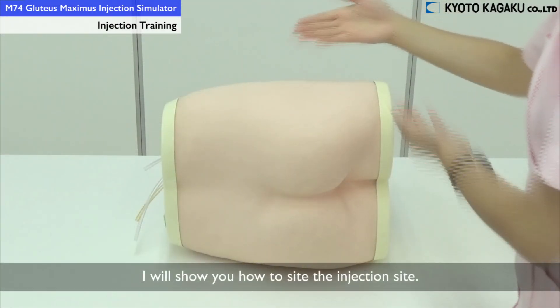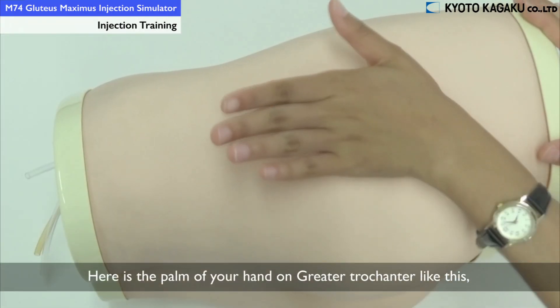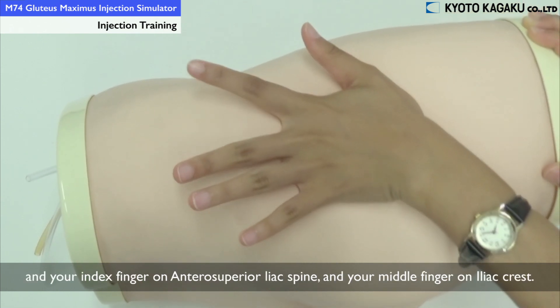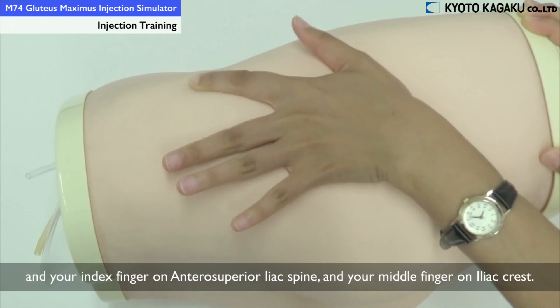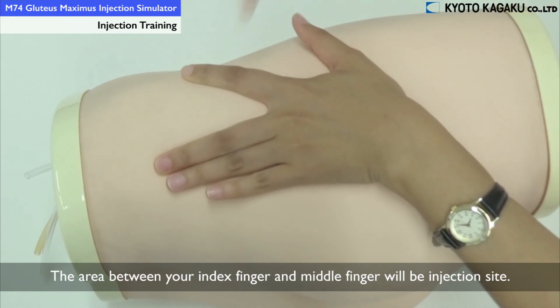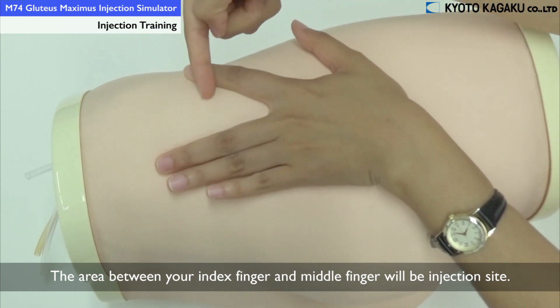Now I will show you how to decide the injection site. Place the palm of your hand on the greater trochanter, your index finger on the iliac spine, and your middle finger on the iliac crest. The area between your index finger and middle finger will be your injection site.